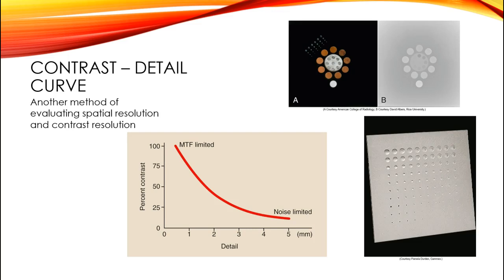Okay, next thing we're going to talk about is called a contrast detail curve. This is another method of evaluating spatial resolution and contrast resolution. The first curves that we talked about were just spatial resolution. This can be used for both.